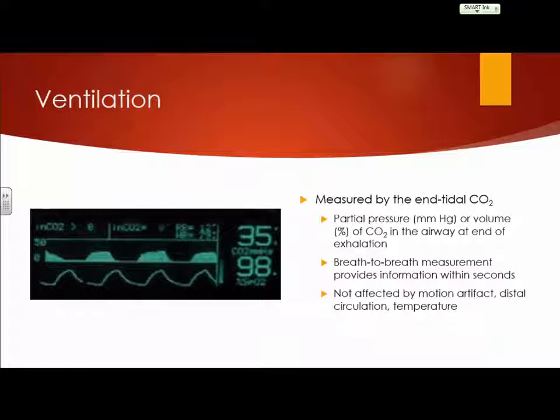So what are we measuring with end-tidal CO2? The partial pressure or the volume in percentage of CO2 in the airway at the end of exhalation. I think I've honed that in. But the good thing about it is that it gives you a breath-to-breath measurement. So each waveform that we see, just like with a cardiogram or EKG, each time we see that complex, we're seeing real-time what's happening with the heart. We're seeing real-time what's happening with inspiration and expiration. It can give you a little bit of information on inspiration, too, and we'll get to that in just a little bit. All right? Not typically affected by motion artifact, distal circulation. Well, it certainly isn't by distal circulation or temperature.